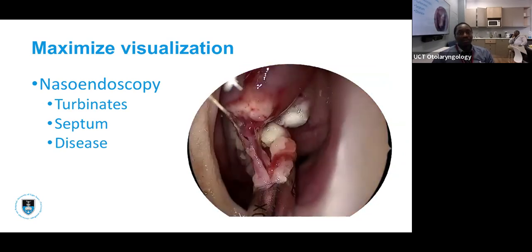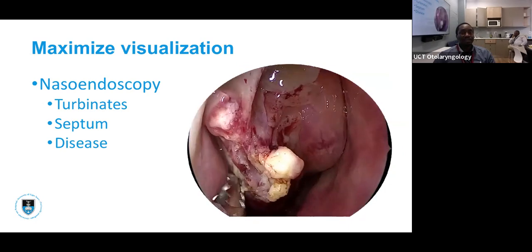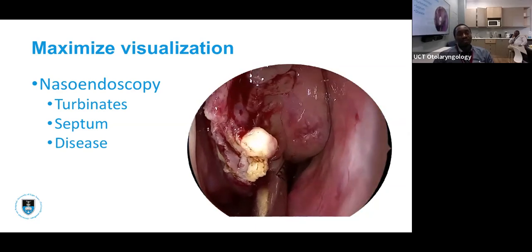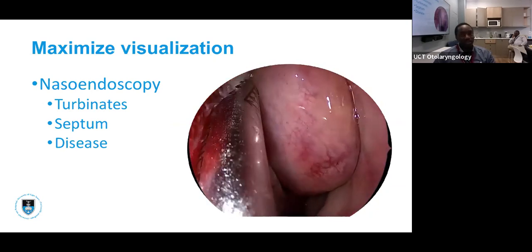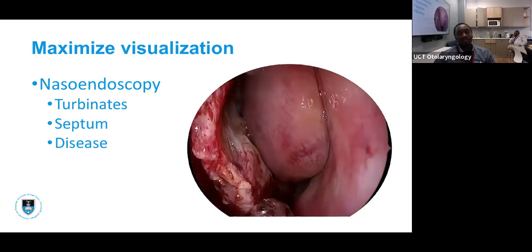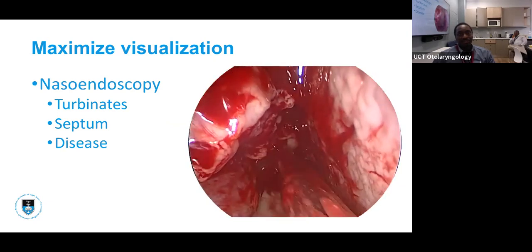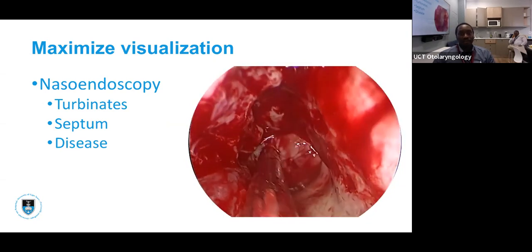In case of presence of disease, it is important that you orient yourself in the anatomical landmarks. For example, here we have the polypoid turbinate, and the polyps are shaved off from the turbinate, and you can clearly see at the end that you can now identify the turbinate in contrast to other pathological or anatomical relation. This big concha, which was infected. And in this case, this is a tumor which is infiltrating the nasal cavity arising from the sinus. So the debulking of the tumor will help you see your landmarks very well and proceed with your surgery safely.